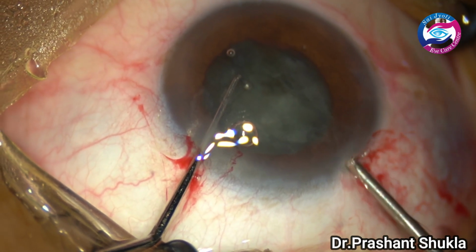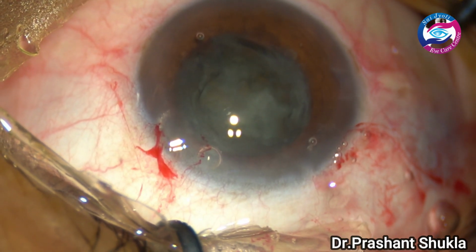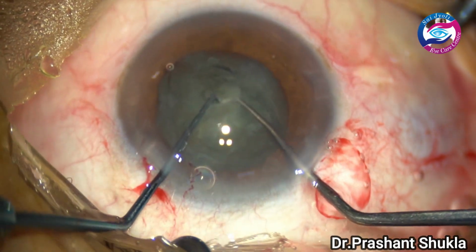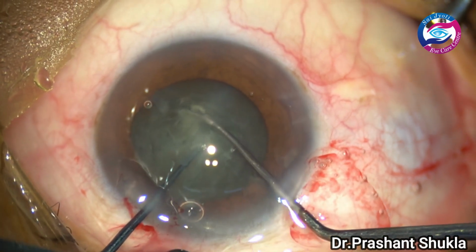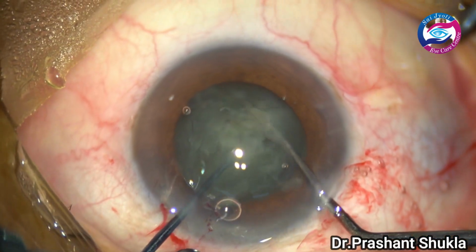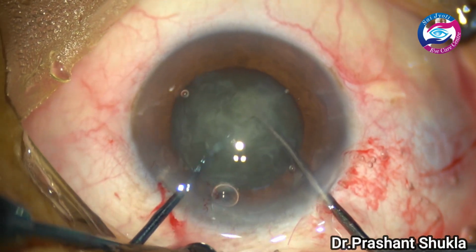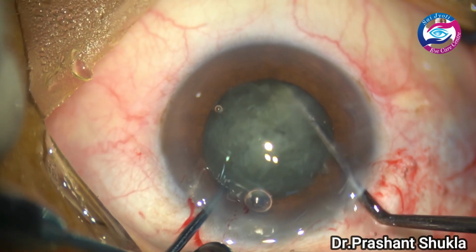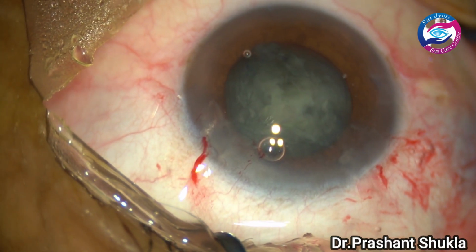The chamber has become shallow, so here I am putting some viscoelastic to form the chamber and have some space. Using two Sinskey instruments, I am just confirming the separation of the nuclear fragments, and I could see that I have got around 2 fragments which are relatively separated. Still the majority of the fragments are attached to each other.